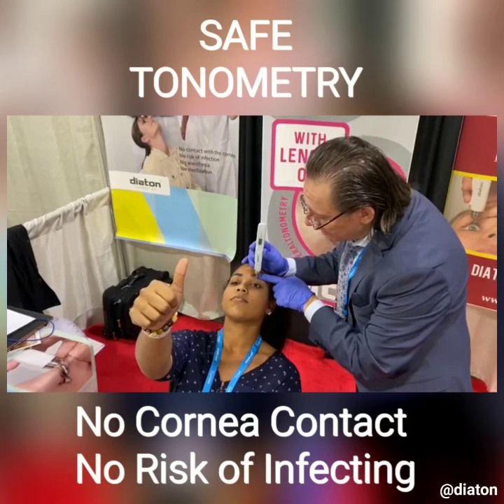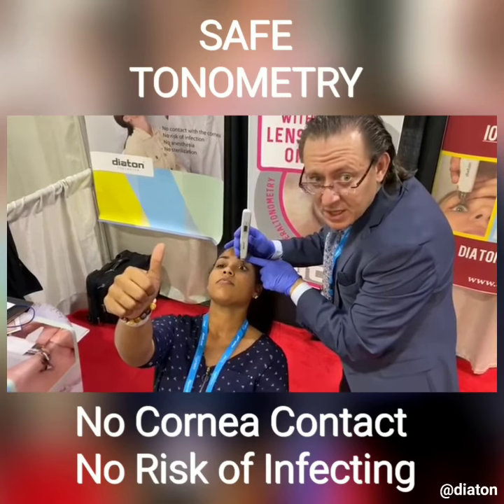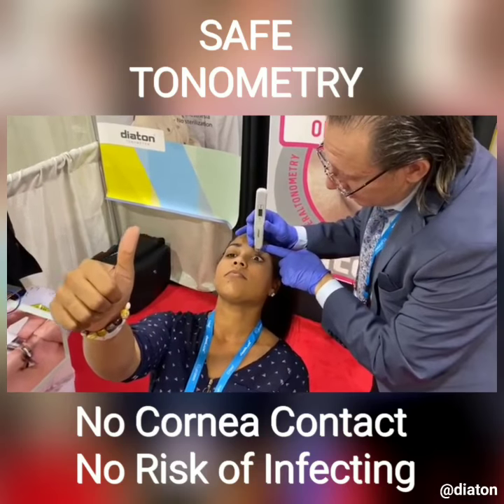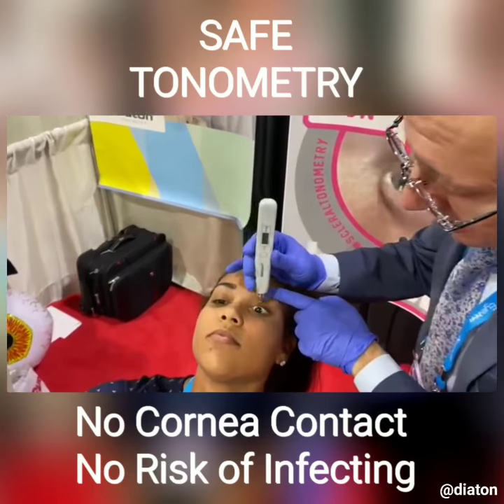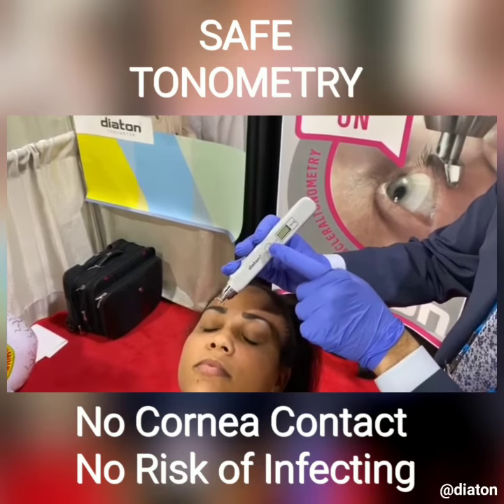I'm wearing a glove. I'm not touching the patient. And we're going over the eyelid. If you don't mind zooming in a little bit, you will see one and two. So we're taking the reading. We've got the.